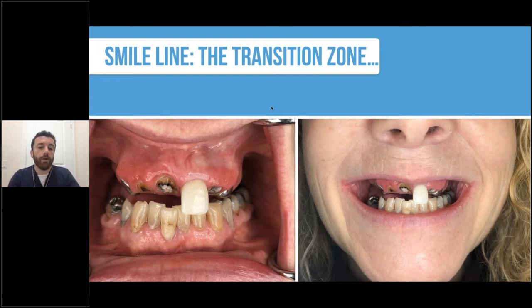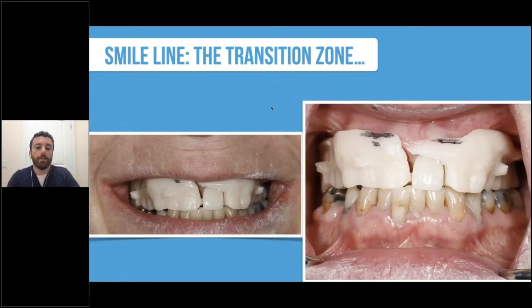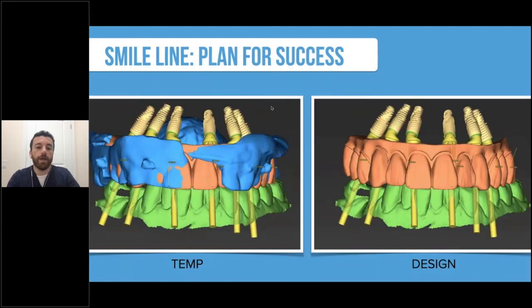In this case, we use something called the dual scan technique for the patient. In essence, we're making a denture and duplicating this denture with markers that are scanned in the CBCT machine. So the patient's going to wear the denture, and then we're going to also scan the denture separately. And you can see here's the denture with these little nubs or markers that are noted in the area. And this helps to translate the ideal vertical dimension for the patient back into our software to design the case digitally. So we now bring the case back into our co-diagnostic software, and we're able to take that temporary design and bring it into the design solution in place for our proposed implant positioning. So this is typically how we're approaching all our All-on-X cases in terms of planning the case backward.